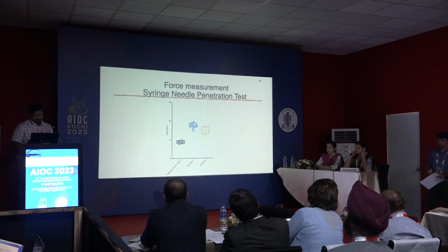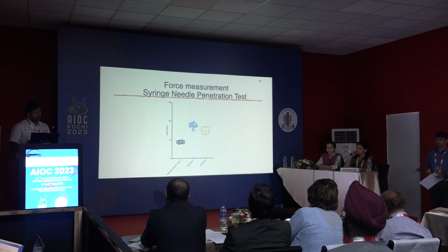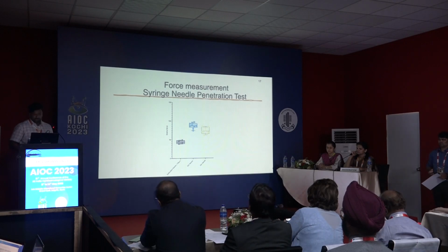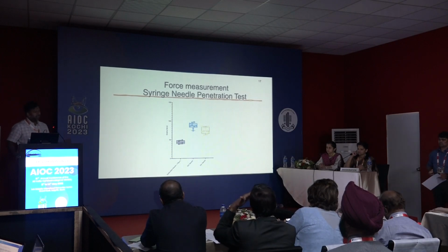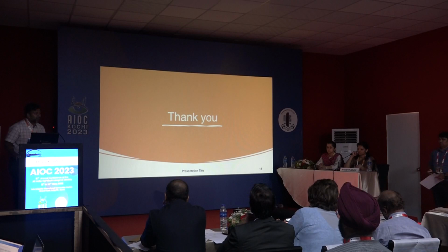And most importantly, with the spatulated needle, the gram force required to puncture the tissue is around 46 gram force, whereas with the 26 gauge needle, it is around 96, almost double, and with the 30 gauge, it is around 87. In a post-vitrectomized eye, when the eye is going to be soft, if you use too much force, there is a high chance you can induce traction. Later on, it can lead to RD. Whereas the needle that we designed is much thinner and much easier to penetrate, causing less traction. Thank you very much.